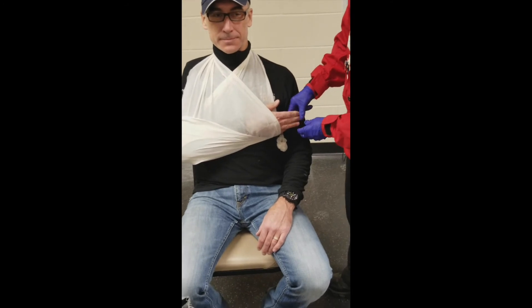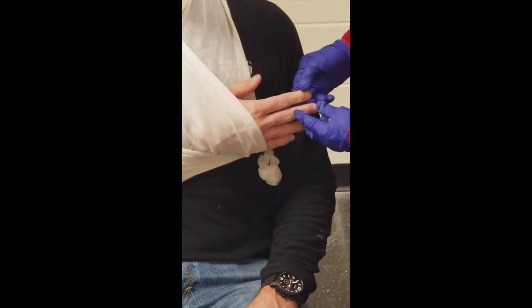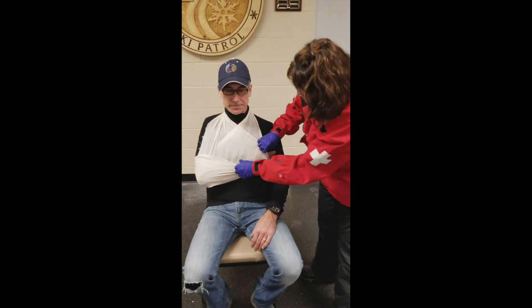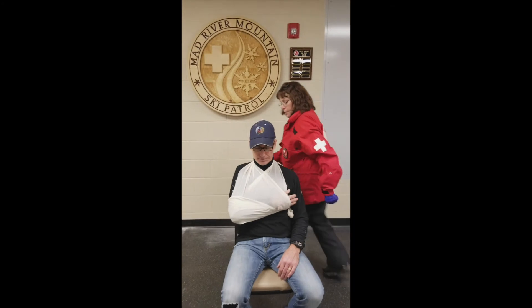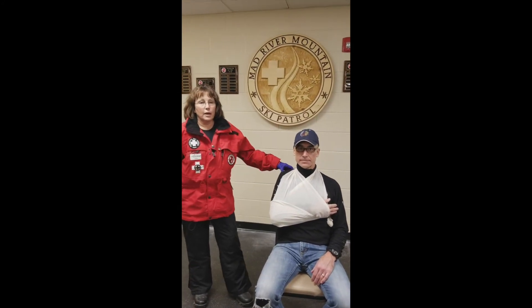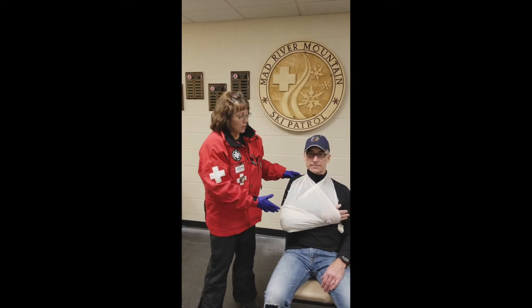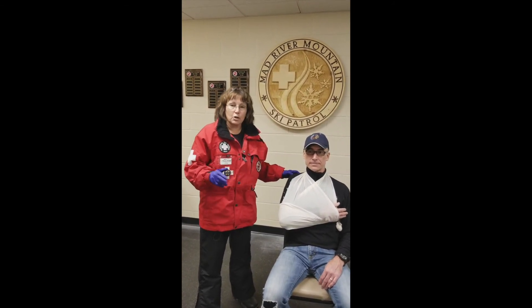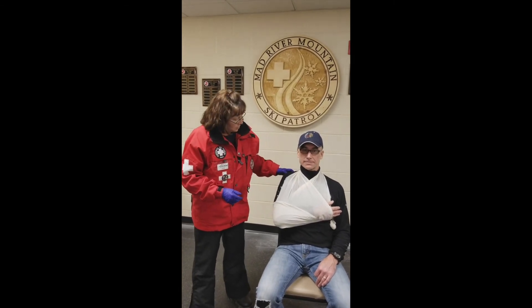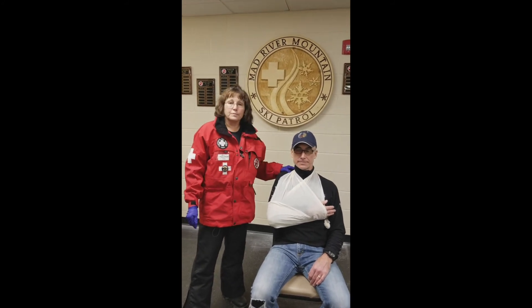And check CMS again. Can you feel me touch your fingers? Yes. Can you wiggle? Check cap refill — within two seconds. You can see this is a way to package the arm up so it stays snug into the body, and it really helps with their ride down the hill. Or if you put it on in the aid room, it helps when they ride in the car if they need to go to the hospital. So that's an overall general way to put on a sling and swathe. Thank you.